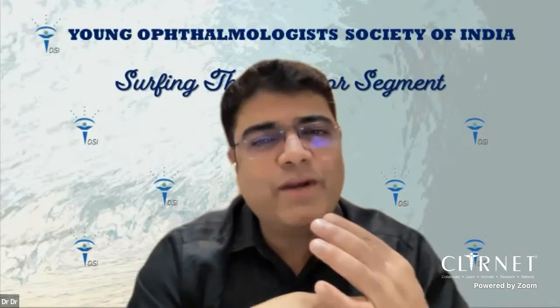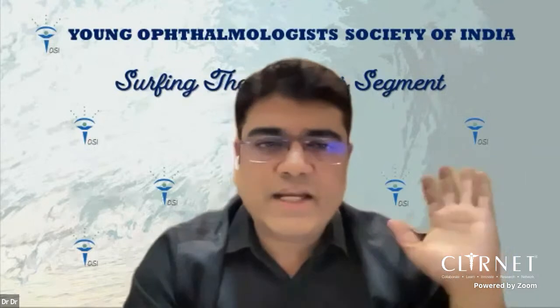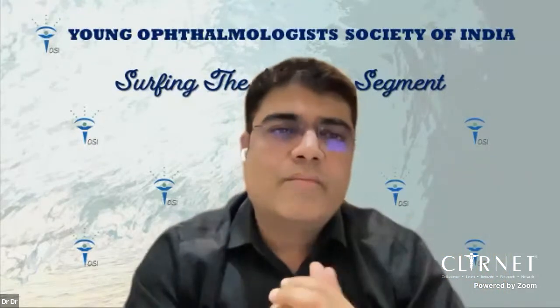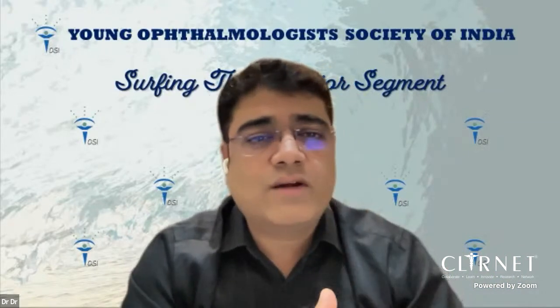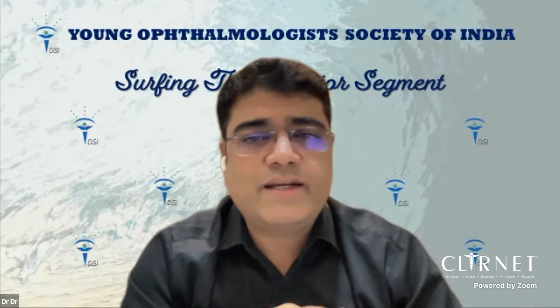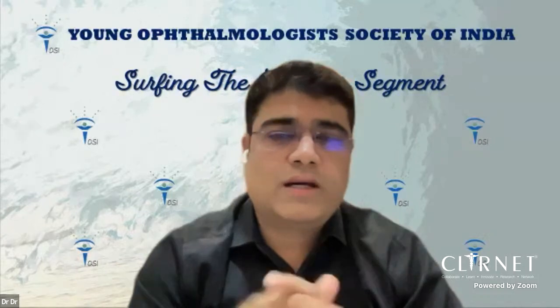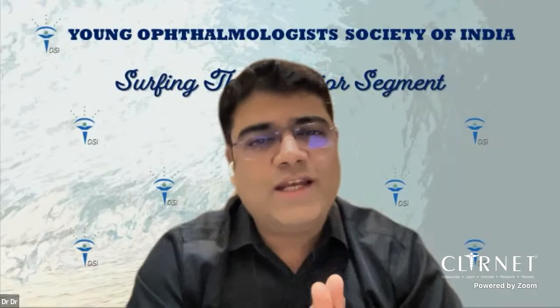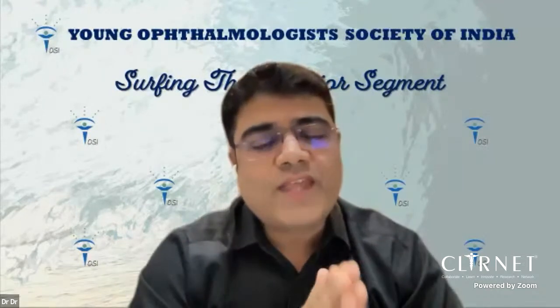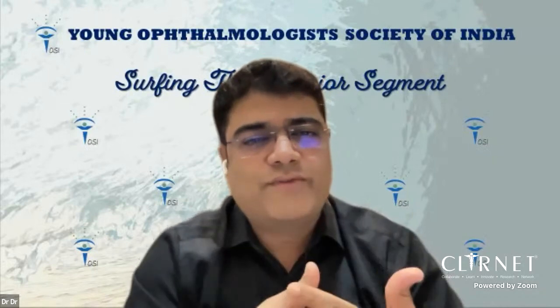For years, we all have been doing limbal vitrectomy only, and pars plana has been advocated years back by many surgeons, but now more and more surgeons are going for pars plana vitrectomy, but it has its own disadvantages. If you're not proficient in doing pars plana vitrectomy, you may end up creating more problems. You don't know how to enter properly, and these are things which we don't do routinely. We do it once in a while, so we can't be very proficient in that.